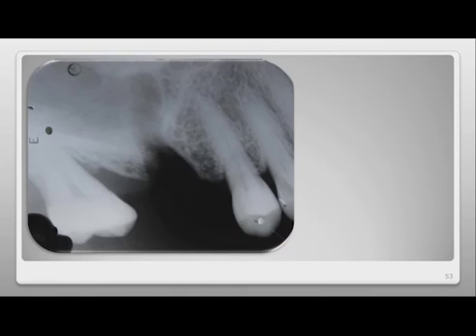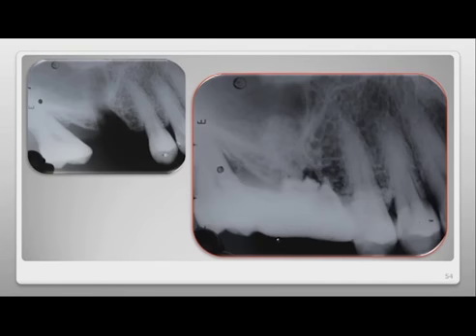And then we see the lesion and the material in this X-ray immediately after inserting the material. In this X-ray, I just made a slight mistake. This X-ray, which we saw and described, did not yet contain the material. Here, we see the graft material. This irregular area that you see is the material that we use as surgical dressing. We took the X-ray with the surgical dressing protecting the wound, but we can observe perfectly how far the material extends. Technically, the collagen membrane would be in this area.